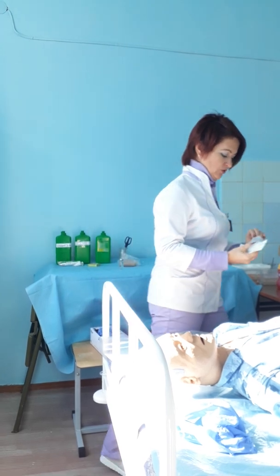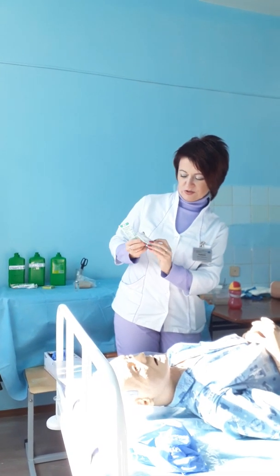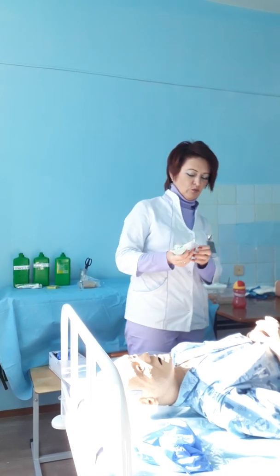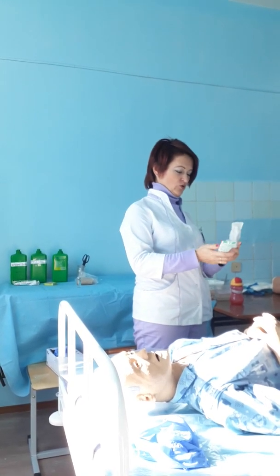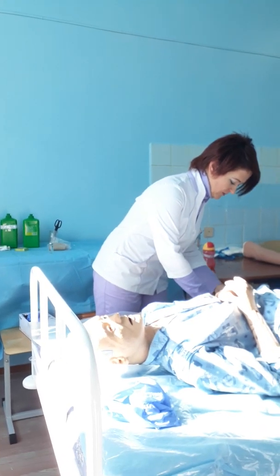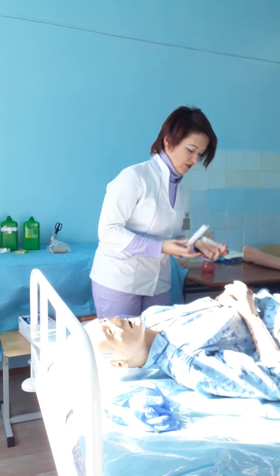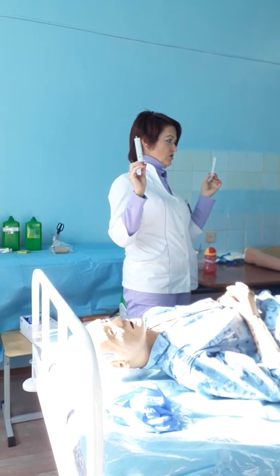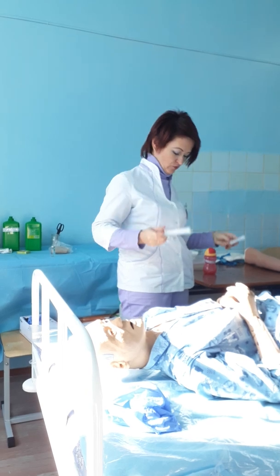When we make the choice, you check the volume, and more often for intravenous injection you will use a syringe of 10 or 20 milliliters. It's the more convenient size for intravenous infusion.